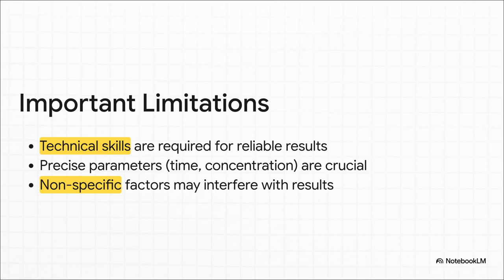However, it does have its limitations. This isn't a foolproof push-a-button kind of test. It actually requires a good amount of technical skill to perform correctly, because things like timing and concentrations have to be absolutely precise. If it's not handled carefully, other factors can sometimes interfere and give you the wrong results.